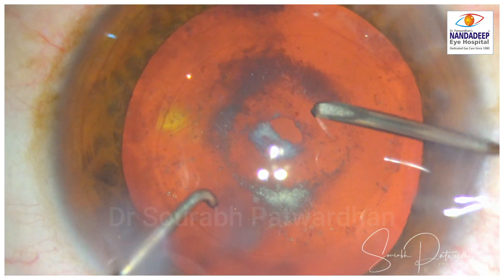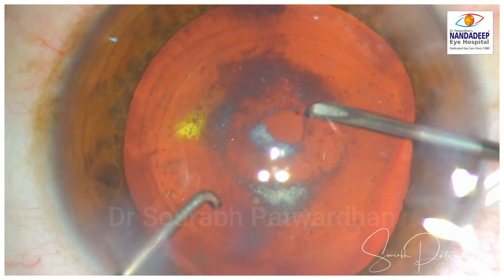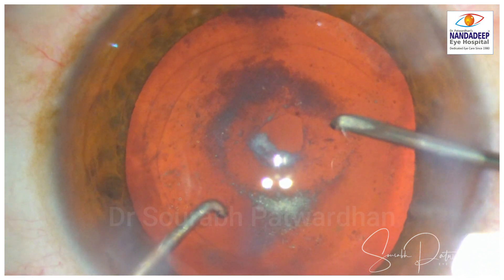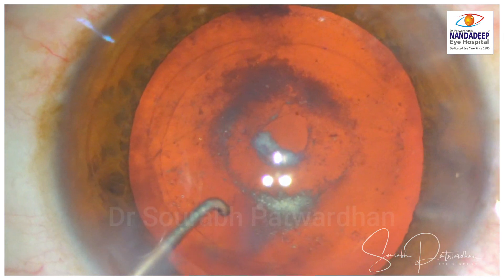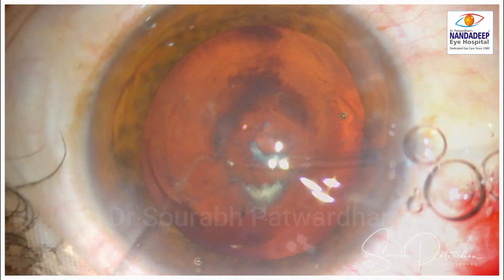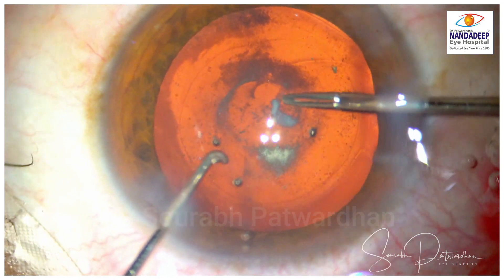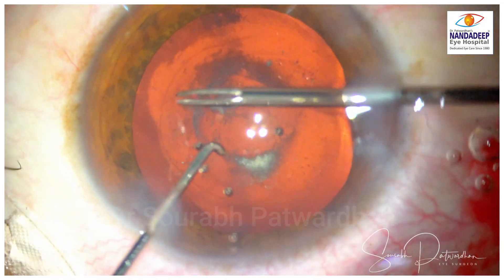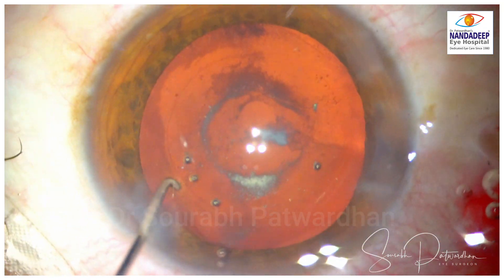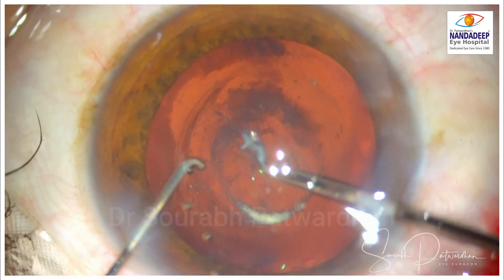I am making another tear at the edge of the pre-existing tear so that I can hold it with micro capsule rhexis forceps. It is very important during posterior capsule rhexis that you maintain the anterior chamber — there should never be shallowing of the anterior chamber, as it may lead to rupture of the anterior hyaloid as it prolapses out. The small posterior capsule rhexis is now complete.